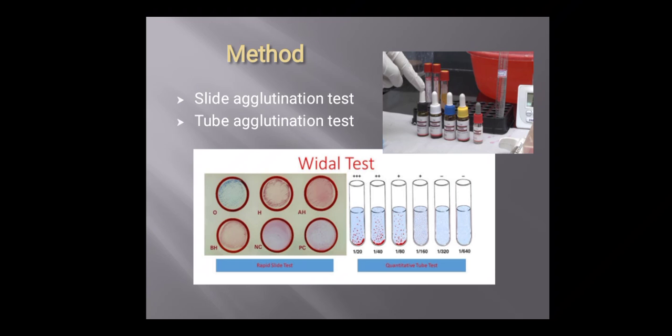Place one drop of patient serum to be tested on each of the required number of reaction circles. Then add one drop of O antigen suspension to the reaction circle containing the positive control and physiological normal saline. Add one drop each of the antigen suspensions—O, H, AH, and BH—to the reaction circles containing the patient's serum.